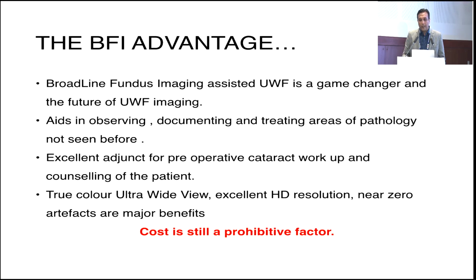And it's an excellent adjunct to pre-operative cataract workup also, and for the counseling of the patient. Excellent HD resolution, near zero artifacts are the major benefits. Of course, the caveat is cost. Cost is still a prohibitive factor.